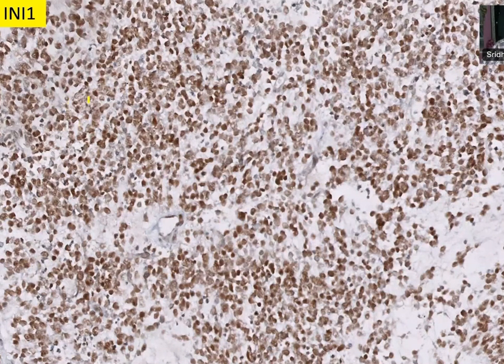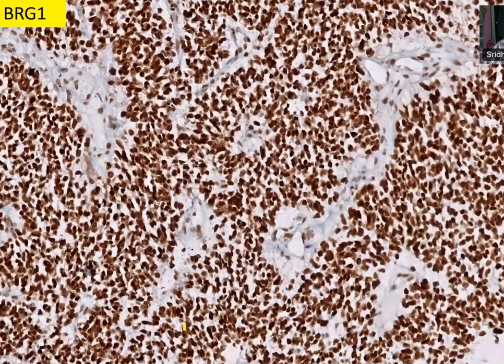How will you interpret INI1 here? Sir, there is a retained expression of INI1. Unlike the last tumor, it is retained here. Okay, this is BRG. What is it? BRG is also retained. So INI1 retained and BRG retained. What does it tell you? Sir, it rules out ATRT.